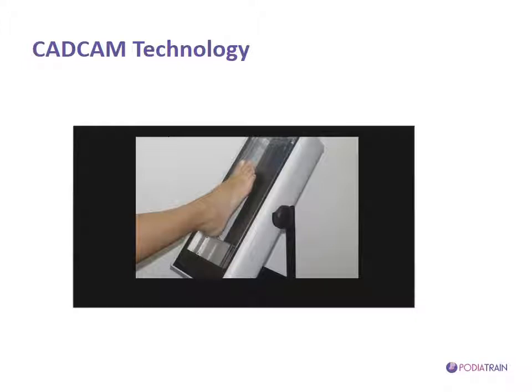First and foremost, however, in my opinion, CAD/CAM systems also give you a lot of safety. We know about the hazards that we encounter in the lab. When we grind our materials, the dust that is given off, which we can inhale, even though we take a lot of precautions.